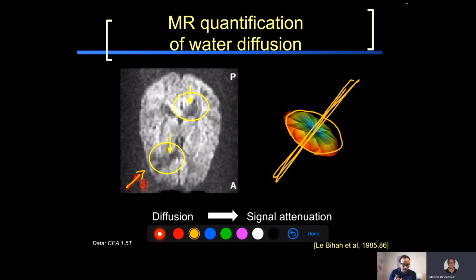And so this is a bit hard to grasp at first in diffusion imaging, but what you're interested in is maybe the direction of axons or how these axons are degenerating with disease, and actually the signal is maxed in the perpendicular plane, so at 90 degrees from it. And as you can see, the signal here and the signal here in the background is quite close. So this is challenging in terms of SNR and noise. And as you will learn this week, there are several ways to denoise and handle noise in DIPY.